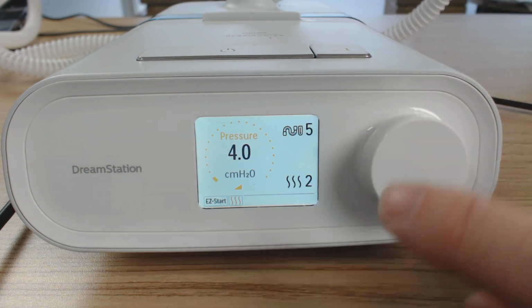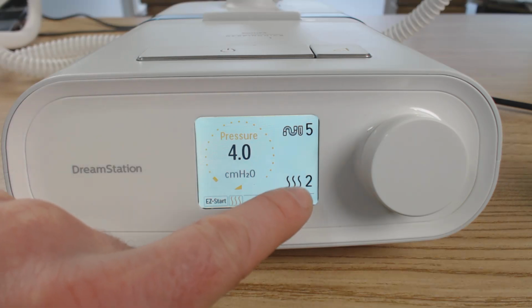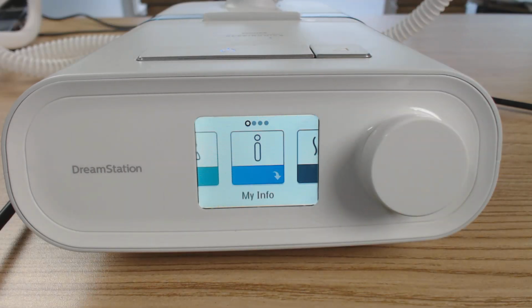So the top being the heated tube, the bottom the level of moisture. This one is determining how hot that heater plate gets, okay, the water chamber, how hot that water heater plate gets and how much moisture is going to be in the air. The top one determines how that copper coil that runs through the tubing heats up. The bigger the number, the hotter the temperature of the tubing. Alright, once we're finished, you can hit the power button there and it's off.